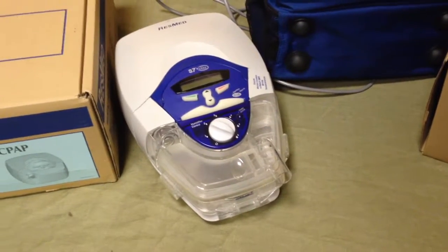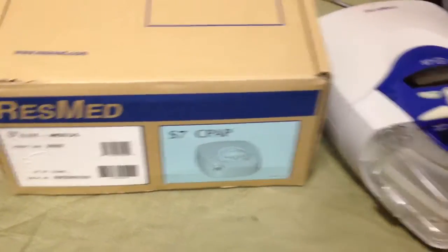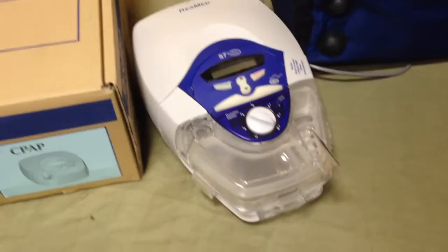The doctor just told you you need a CPAP machine and here is one. This is the S7 CPAP. Just came out of an estate. We don't need it and it's in great condition. Let's go through it.